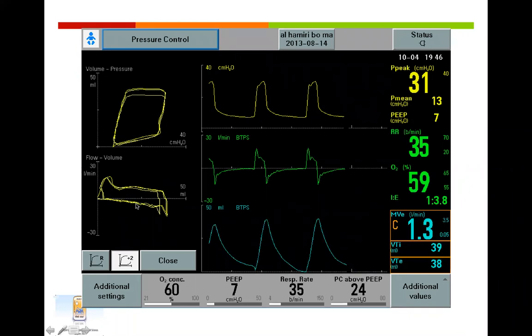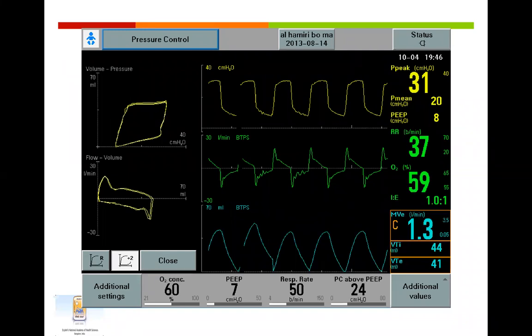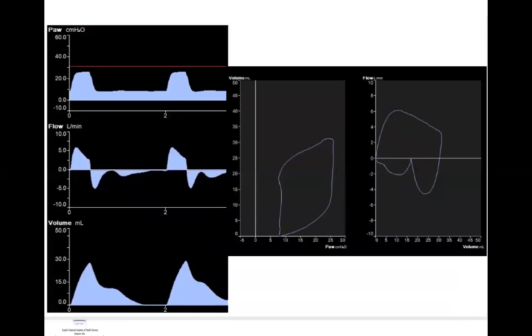Again, the expiration is prolonged. That is what is happening. And then you are decreasing, and it is actually reduced too much, I think. So we have to see. Isn't this low base flow or tube resistance which causes this? If you see the flow volume curve, it's very prolonged. This goes with low base flow in the settings. If the flow is less, we would see this as triangular and this as rectangular, which is not happening. So that's not the point here. Flow is fine. So sometimes you will see this; when will you see this kind of thing?